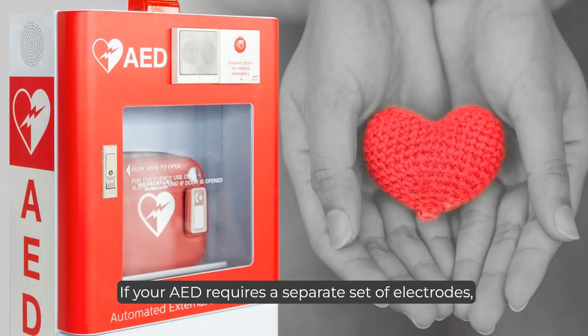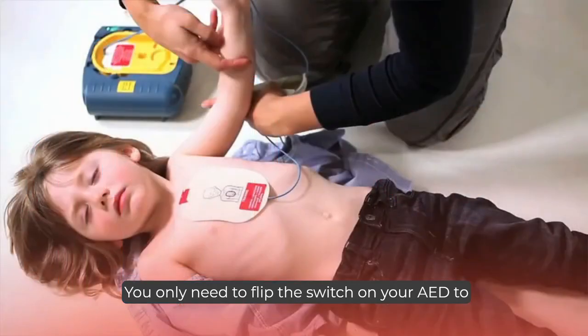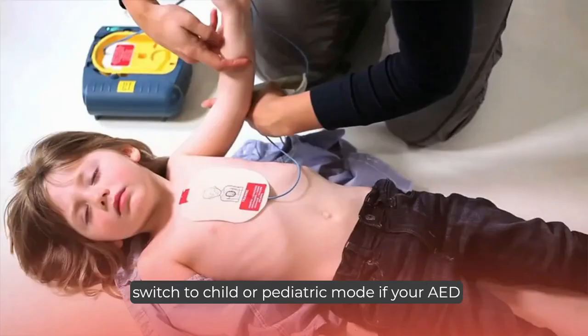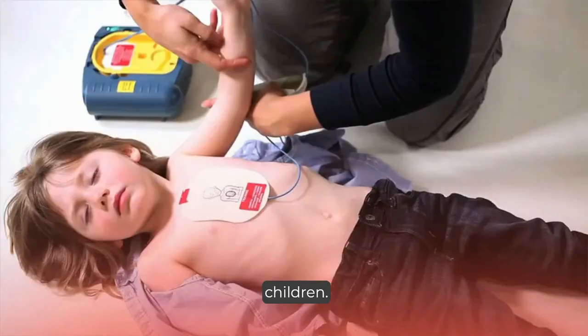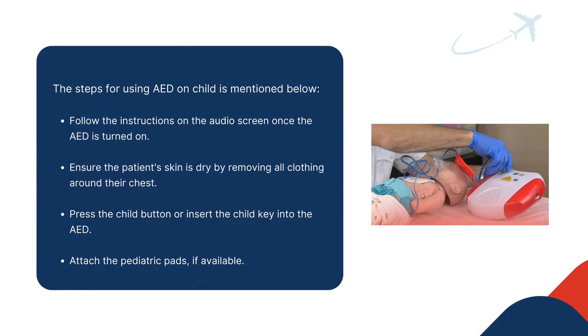If your AED requires a separate set of electrodes, you will need to install the child pads during the emergency, power on the AED, and listen to the voice prompts just like you would for an adult patient. You only need to flip the switch on your AED to switch to child or pediatric mode if your AED allows you to use the same pads for adults and children. In addition, children's pads are placed differently than adults'. The steps for using an AED on a child are mentioned below.